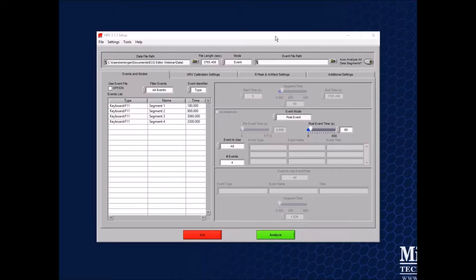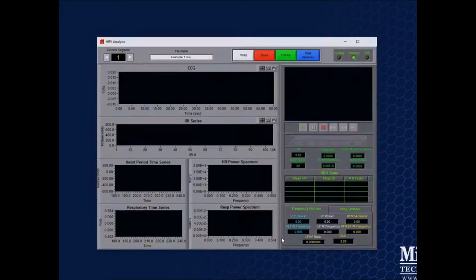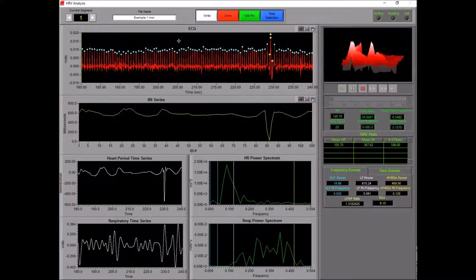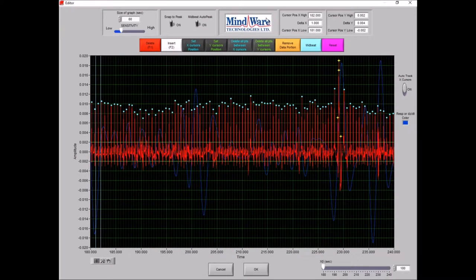Now I've switched over to the HRV application and I'm going to pull up the analysis screen. We can see many blue dots marking R peaks — the application's way of saying they are most likely correct placements. There are some yellow dots near the end of the segment drawing our attention to a potential problem area. We can clearly see the data changes there, but to address it, we need to go into the Edit R's screen. I'm going to click on the Edit R's button to bring up the ECG editor.